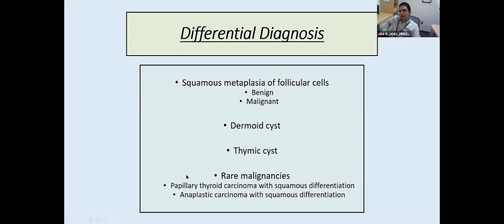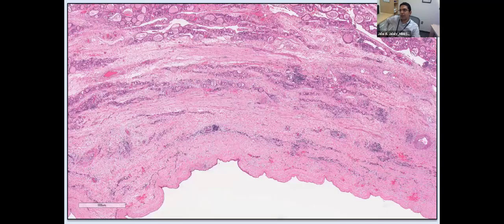So this was signed out as squamous cell lined cyst and cystic debris, but underwent a lobectomy. And you can see here that in the surgical pathology specimen, we do definitely have a cystic wall with some inflammation and normal follicular cells in the background without any features of PTC.